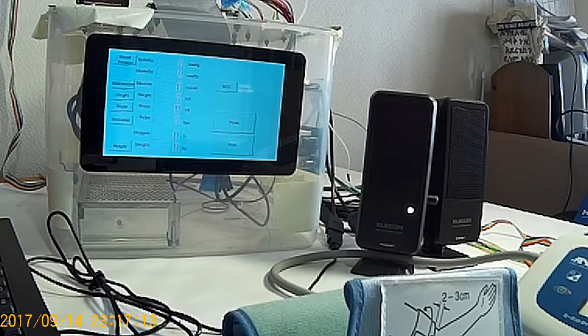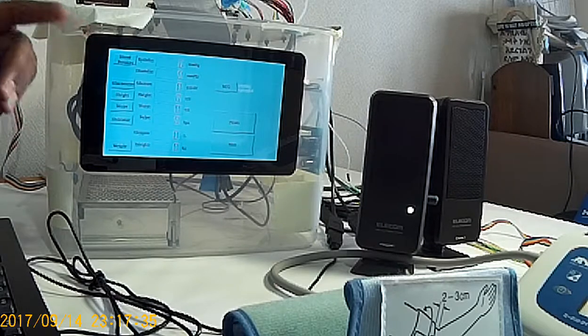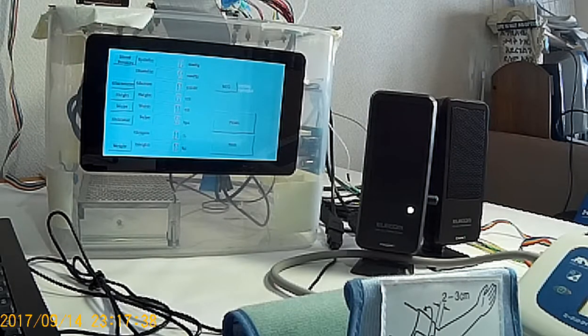To use the medical devices, please follow the printed instructions. Okay, in this case, we have heard the voice command prompting to read the printed instructions available with the EHealth kiosk, assuming it's going to be a real user scenario. So printed instructions will be there, for instance, how to use the blood pressure measurement device, how to use the glucometer, a kind of quick infographic presentation which guides the user to make good use of the EHealth kiosk.